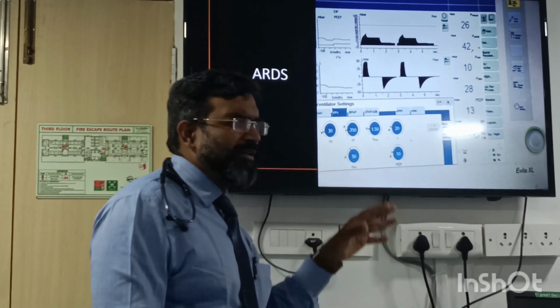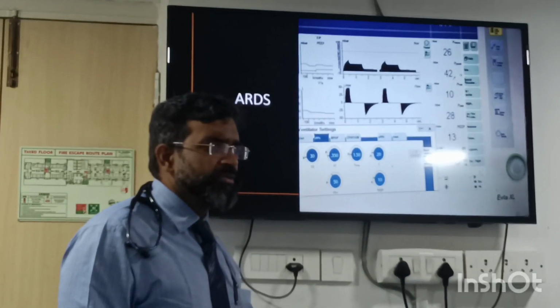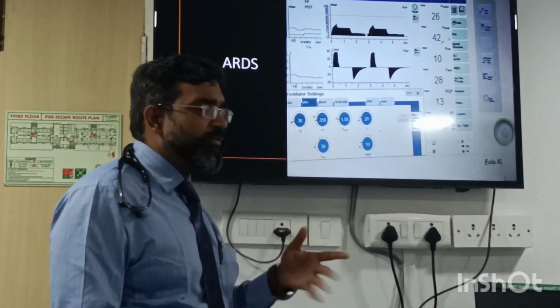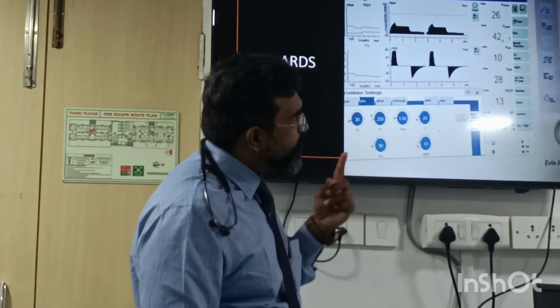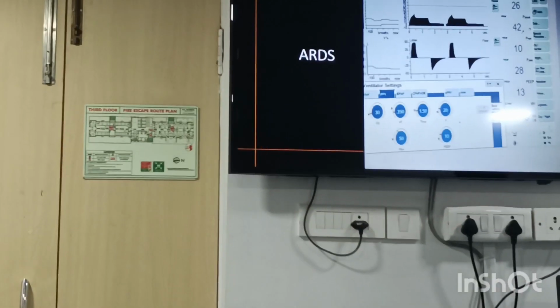But you must understand there are certain features on this ventilator that will probably help you out. That's all. All ventilators will not have these features. You may want to keep the I constant, but I must see my peak pressures and my plateau pressures. My flow characteristics may change, and resistance will increase.